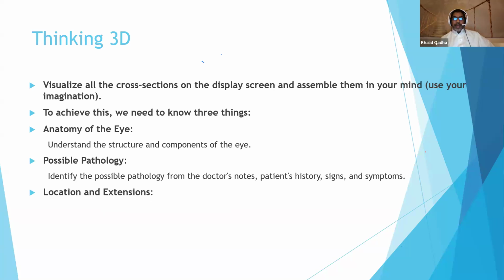And locating the extension of the pathology, as I said earlier, by using the transverse and the longitudinal cuts, and determine which hours this extension is going for.